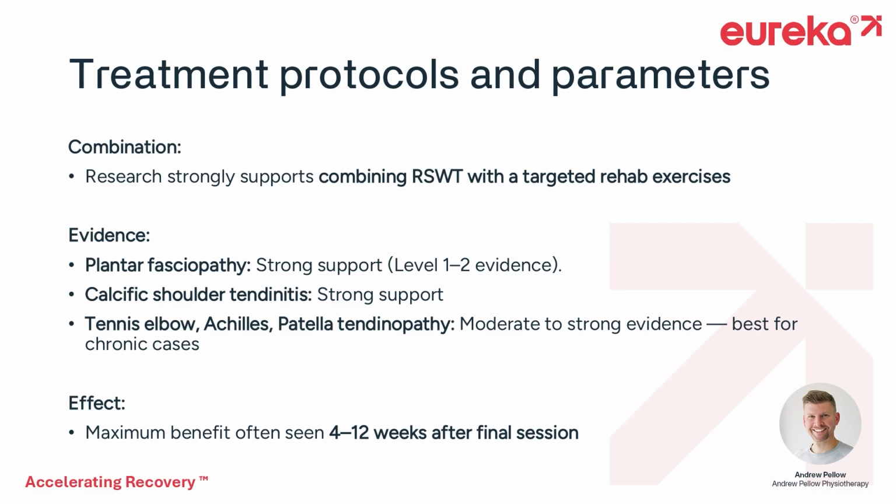There is strong evidence supporting the use of radial shockwave therapy for plantar fasciopathy. Calcific shoulder tendinopathy also has strong support, as it is good for breaking down calcium deposits. For tennis elbow, Achilles and patellar tendinopathy, there is moderate to strong evidence supporting the use of shockwave therapy, but it is best suited for chronic cases.